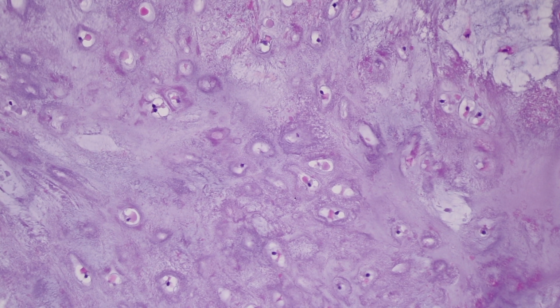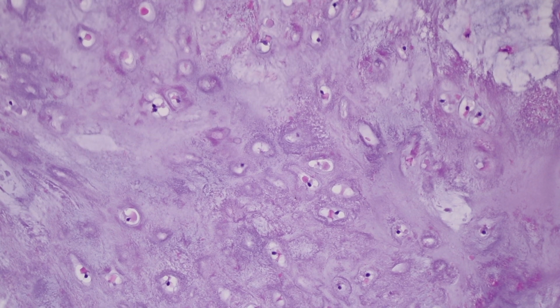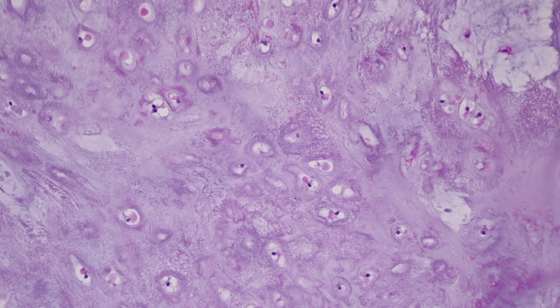Okay, I will answer that question. When there is infiltration, let's just say hypothetically this case shows infiltration, one would expect to see a small fragment of cartilage like we see here, in the center of which is a pre-existing bony trabeculum. So the bony trabeculum would be right here. I only have a small piece, but I can see that it's infiltration.